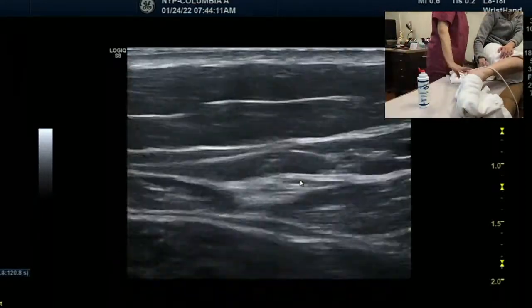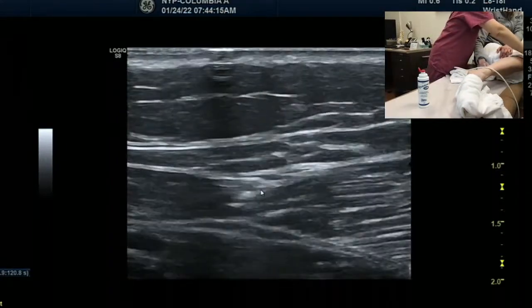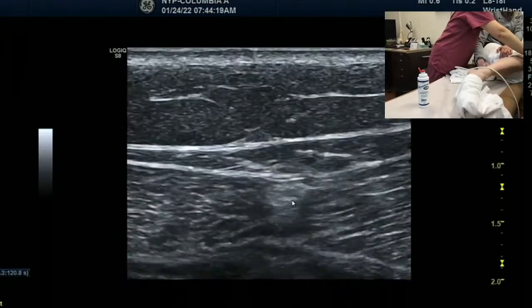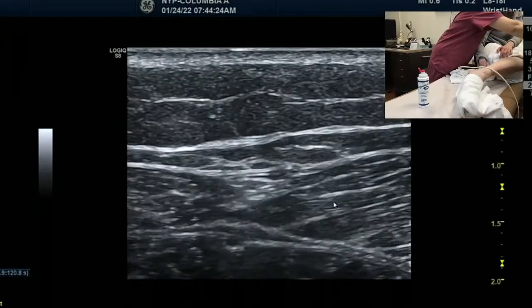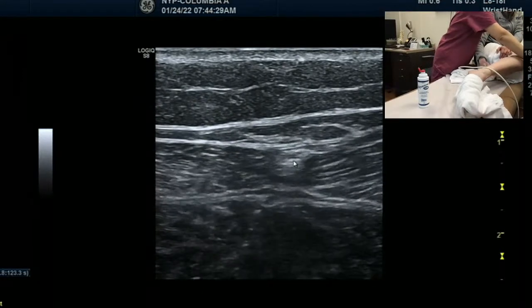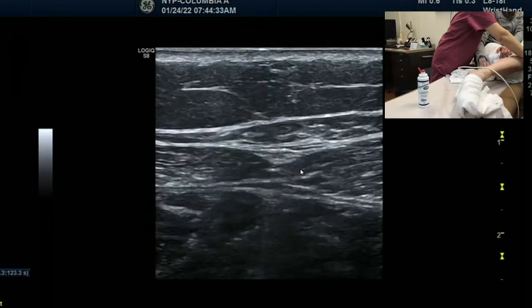Things are going well. Listen. And if I toggle, I think that's the best. Right there. Listen. Now we know. But if we don't scan and follow the nerve, it's very hard to know.